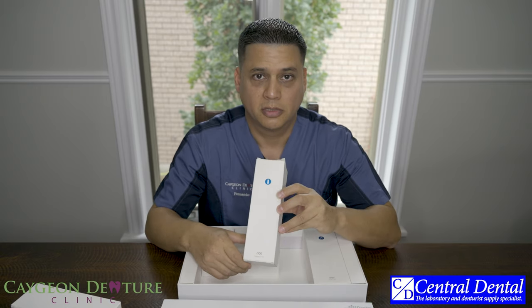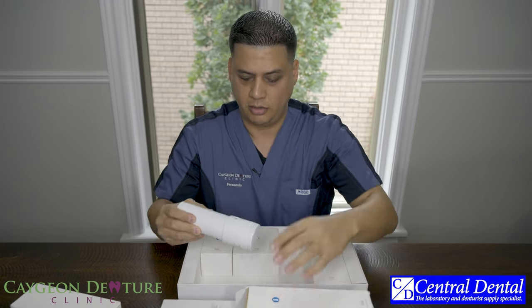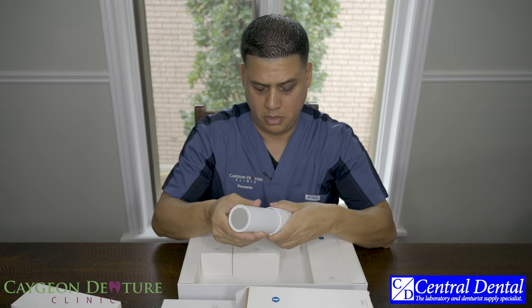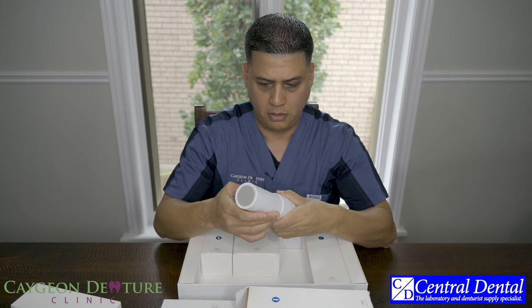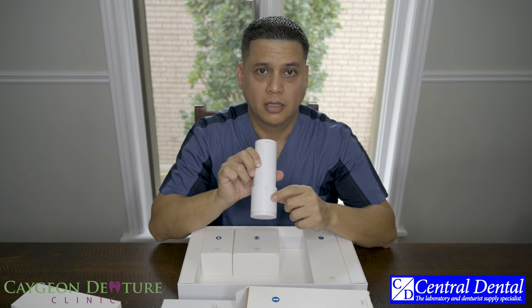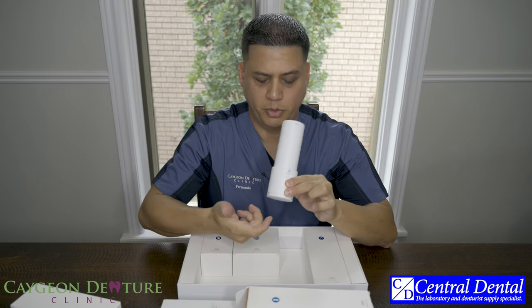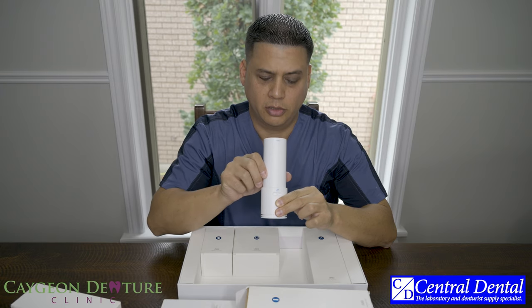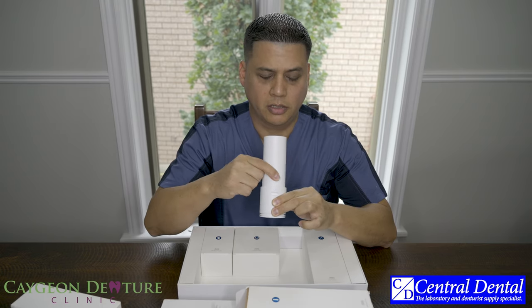This is the calibration tool. It's fairly big but pretty cool. I already used it when I turned on the scanner for the first time and it's fairly intuitive. You can see it gives you different options — it goes from level one to level seven. All you have to do is put the scanner inside, and the software tells you to start at number one. When the software says it's ready, it tells you to spin it over to number two.